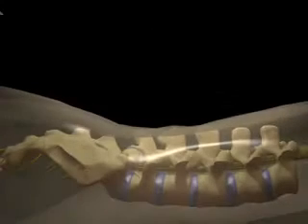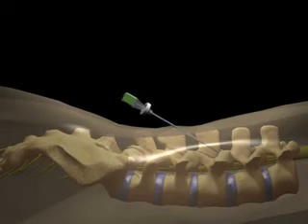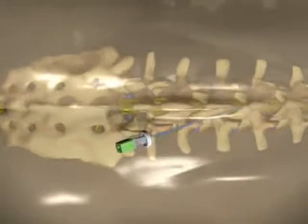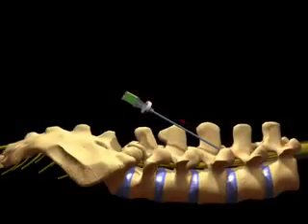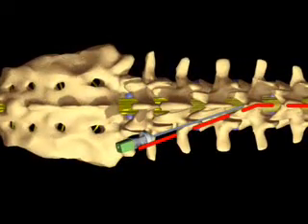A paramedian oblique needle placement technique offers several advantages over the midline technique. With paramedian oblique placement, the site of needle entry through the skin is lateral to the spinous processes. The lateral coordinate for skin entry is parallel to the vertebral pedicle, approximately 1 to 2 centimeters off of midline. Entry is 1 to 1.5 vertebral levels below the interlaminar space through which the needle will pass, creating a shallow entry angle. The imaging target for the needle tip is the midline of the selected interlaminar space.